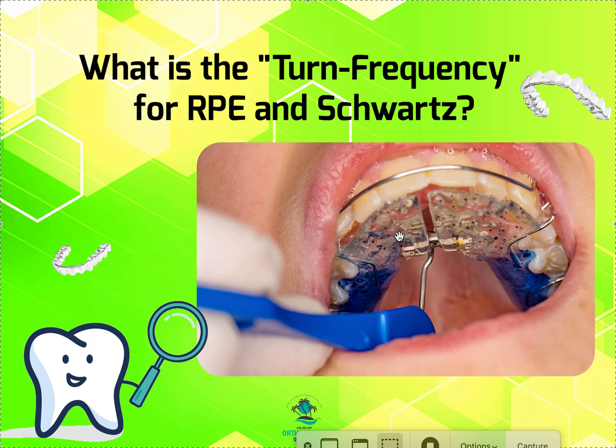Parents can get a little bit defensive, like, hey, I'm doing it. Yeah, I totally believe you are, but it can get tricky. Let me watch you do a turn and let's just see how you're doing it. Maybe we can find ways for you to optimize that turn a little bit better so that you're getting the outcome that we want, because what you're telling me is not what I'm seeing. So I want to know if there's a problem with your appliance, or perhaps the cogwheel's defective, or perhaps you're just not quite turning it correctly. And 9 times out of 10, it's that they're not turning it correctly.